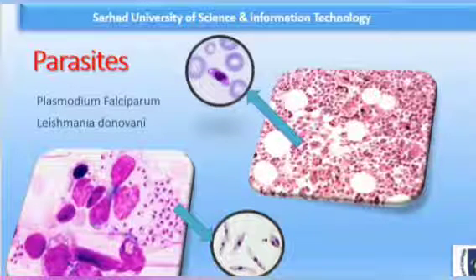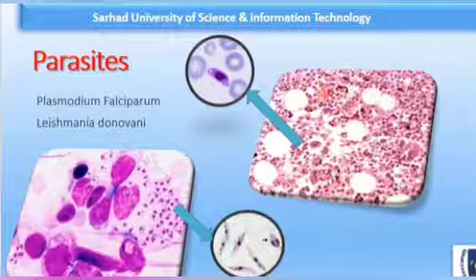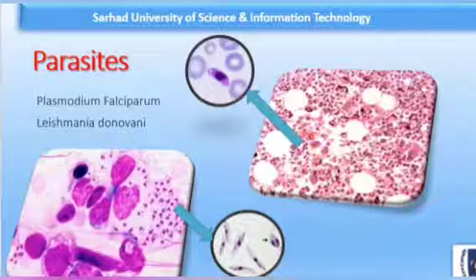You are also examining for the presence of parasites, particularly Plasmodium falciparum. Like this is a bone marrow smear, and here it is zoomed.